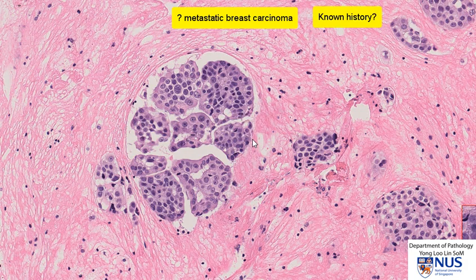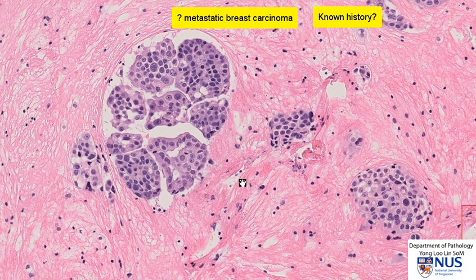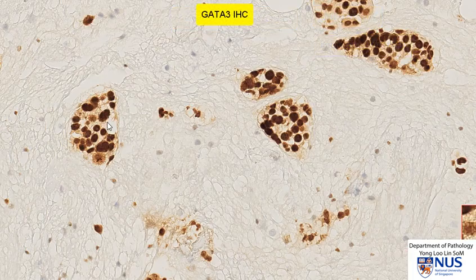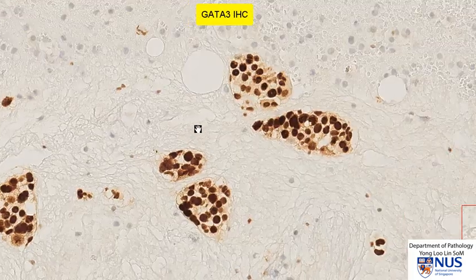We would also be considering other adenocarcinomas including lung and gastrointestinal tract, for example, if there is no history. With this particular patient, we would want to do some immunohistochemistry. This is GATA3, which is an immunohistochemical marker for breast.